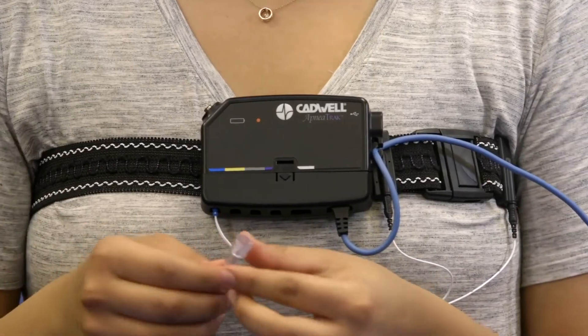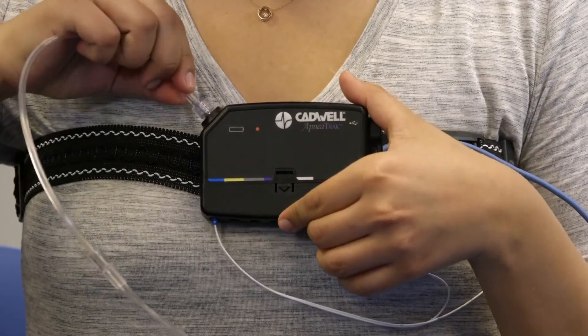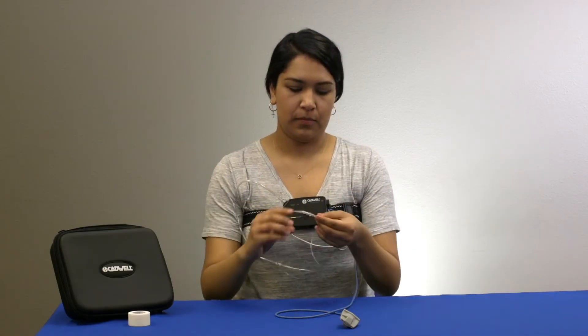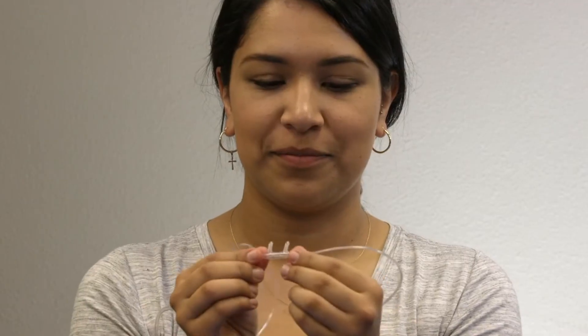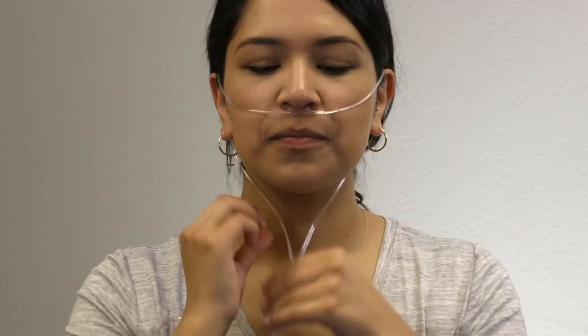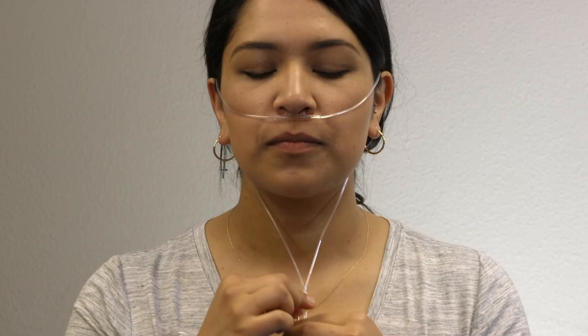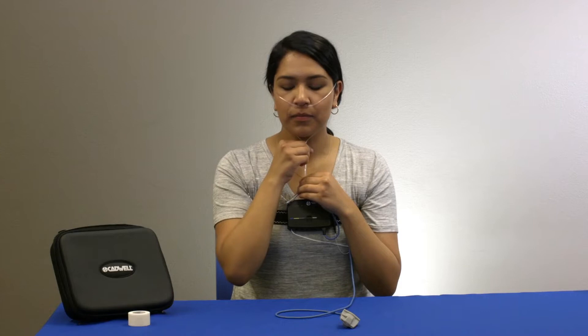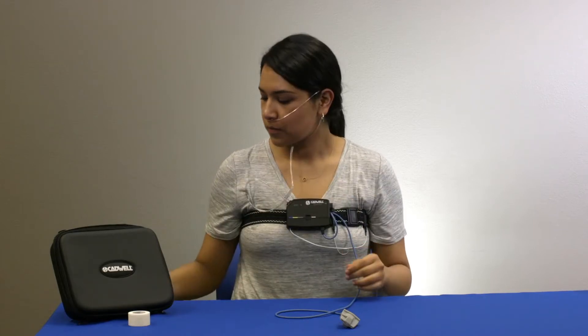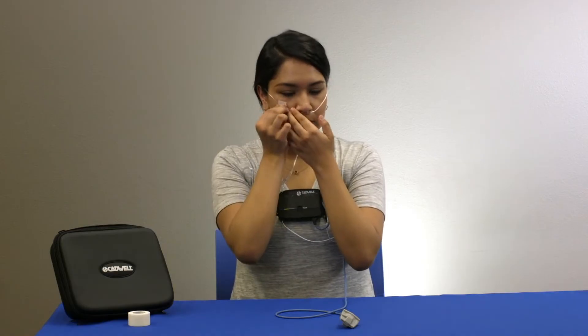Attach the cannula by gently twisting the tube onto the metal connector on the top of the apnea track. Holding the cannula with the prongs facing towards you and curving down, insert the prongs into your nose and pull the cannula tube back over your ears like a pair of glasses so that the tube sits in front of your neck. Slide the tension adjusters up the cannula tubing — this should not be tight or uncomfortable. Tear off two small pieces of tape and secure the tubing to your cheeks.